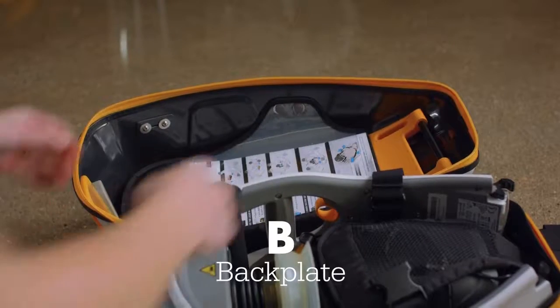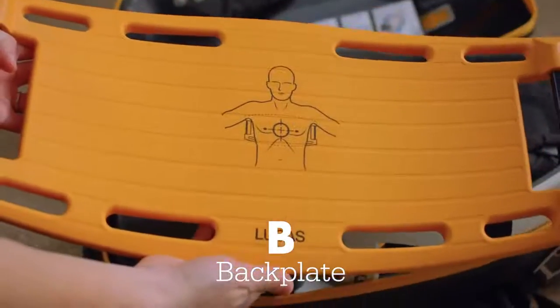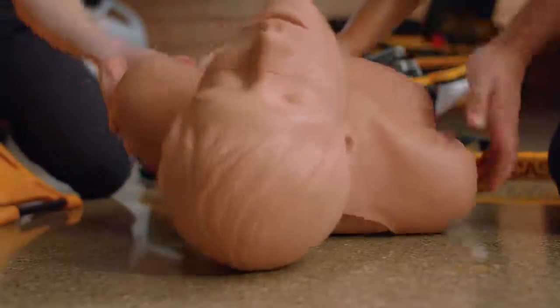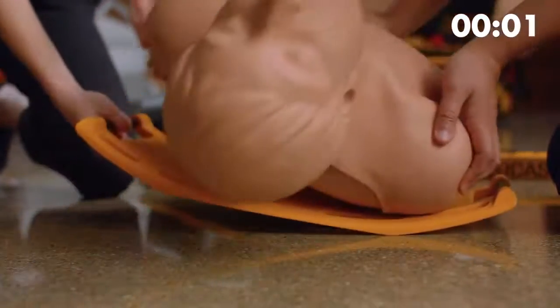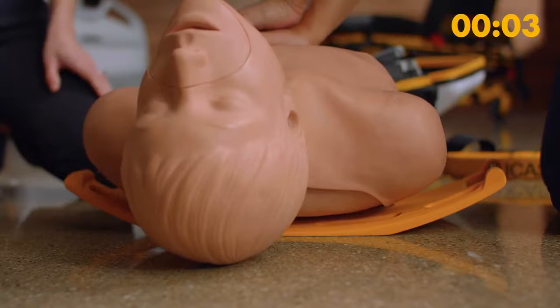B stands for backplate. Remove the backplate from the top of the case. Notice the suggested placement marker diagram for reference. Coordinate a natural pause in compressions with your partner and place the backplate under the patient. This will be your first hands-off moment. If coordinated well, this should only create a few seconds off the chest. Once the backplate is under the patient, your partner can immediately resume manual compressions.